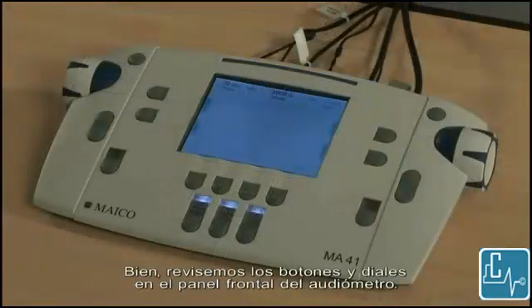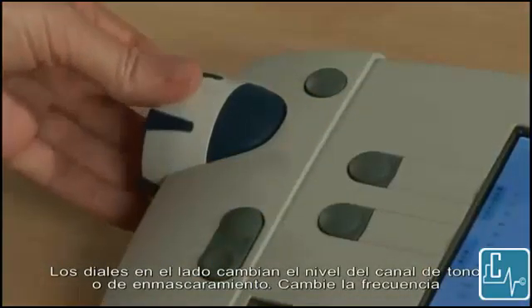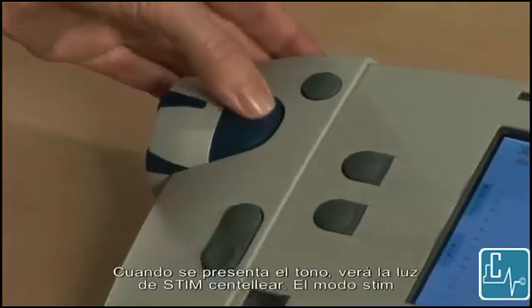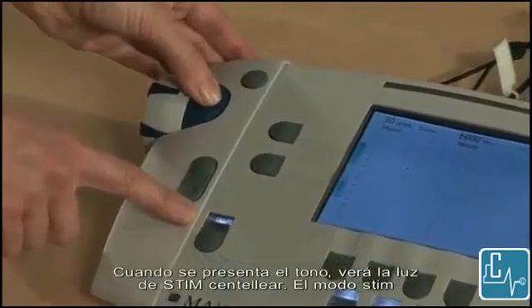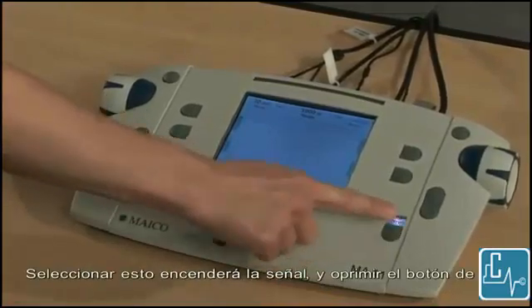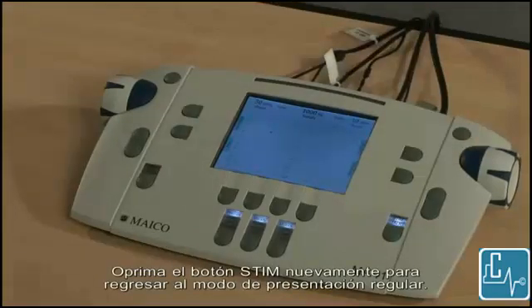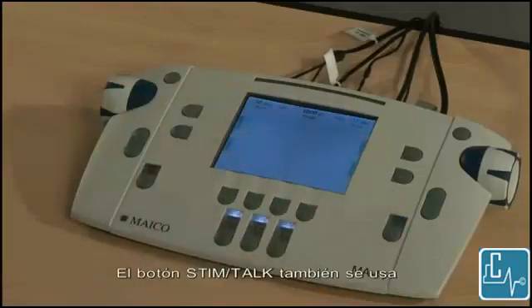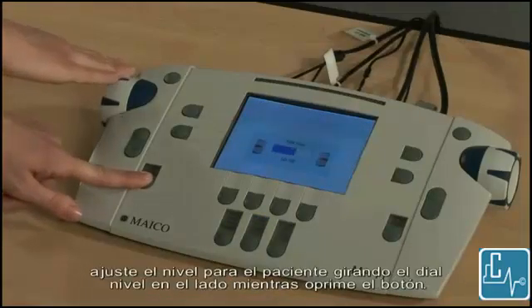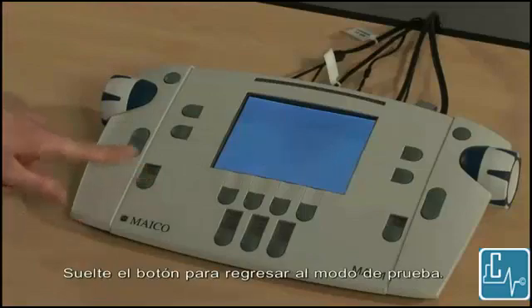Let's review the buttons and dials on the front panel of the audiometer. The dials on the side change level for the tone or masking channel. Change frequency using the plus or minus button, and present the tone using the blue button next to the dial. You will see the stim light flash when the tone is presented. The stim mode for masking or the tone can also be changed to interrupt mode using the stim button. Selecting this will turn the signal on, and pressing the blue presentation button will then interrupt the signal. Press the stim button again to toggle back to regular presentation mode. The stim talk button is also used for talk forward to the patient. Press and hold the button to talk to the patient. Adjust the level to the patient by turning the level dial on the side while the button is pressed. Let go of the button to return to test mode.